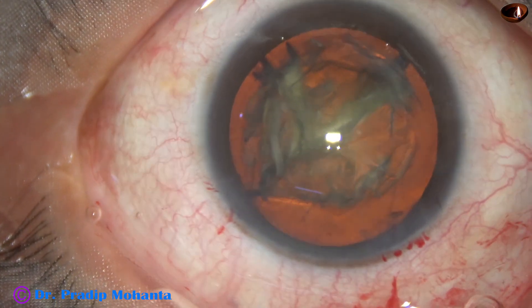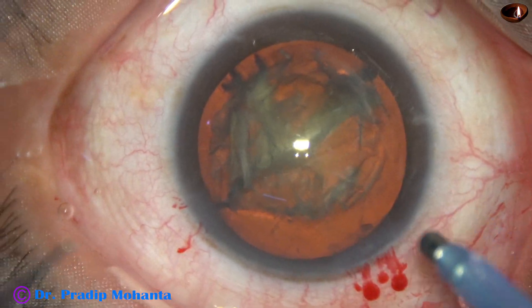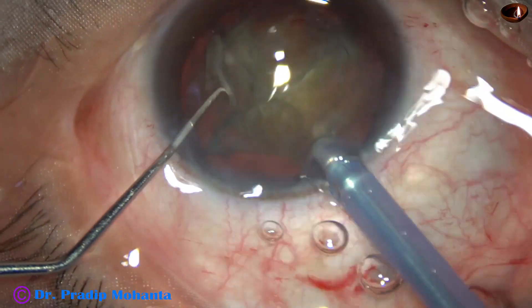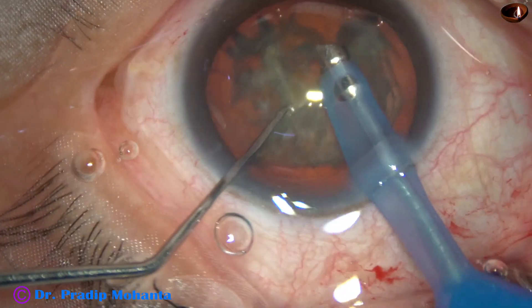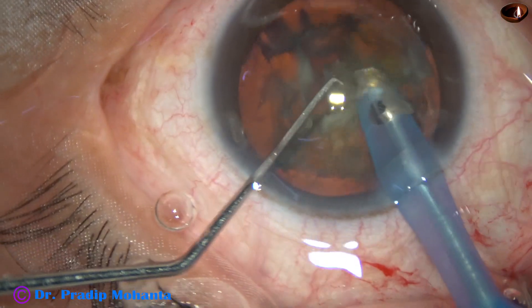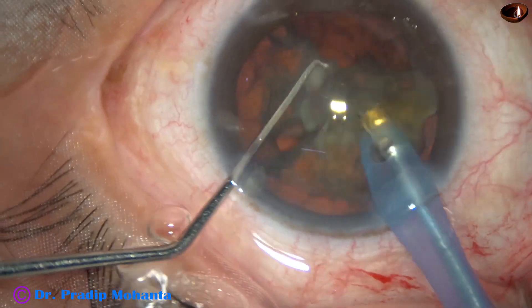And now I just go in and pick up the smaller pieces and start emulsifying. Go in, aspirate some superficial cortical lens matter, hold one piece and start emulsifying that piece.